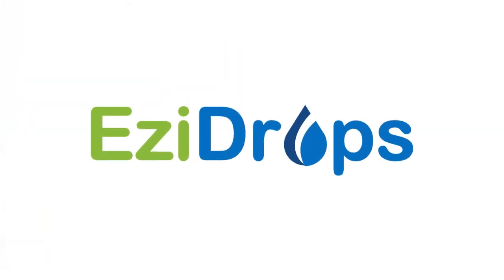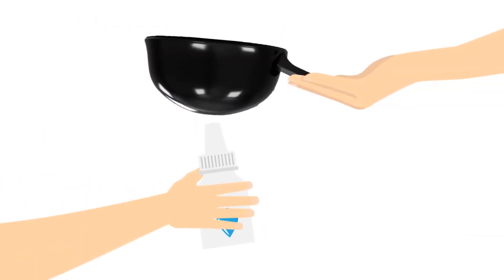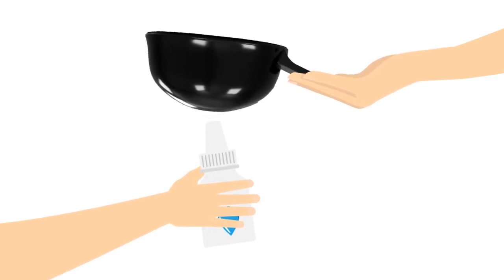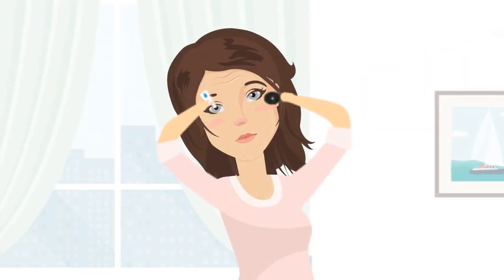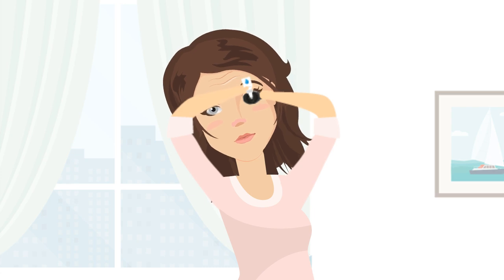Here's how EziDrops works. First, sit down on a chair, or for some people, it might help to lie down. Hold the EziDrops applicator by the handle and turn it upside down. Put the bottle's nozzle directly into the centre of the EziDrops applicator. Now raise both the bottle and applicator onto the eye. Tilt your head back until the applicator is horizontally flat upon your eye.